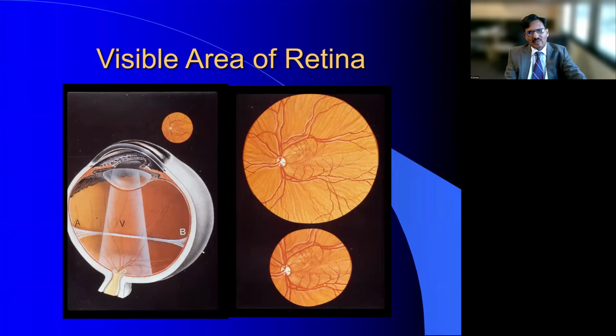and the technical aspects of delivering either depression or cutting or lasering mean that you need to be more precise and more accurate, because your maneuvers are a function of what you're actually visualizing. And if you don't see well, you can do more damage than good.